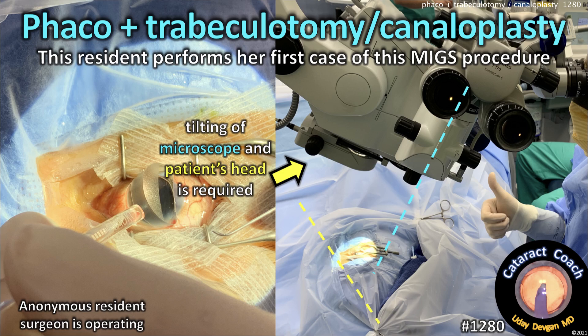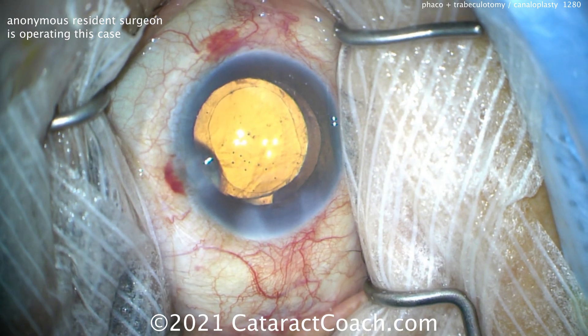CataractCoach.com. FACO plus trabeculotomy and canaloplasty. So this resident performs her very first case of this MIGS procedure.